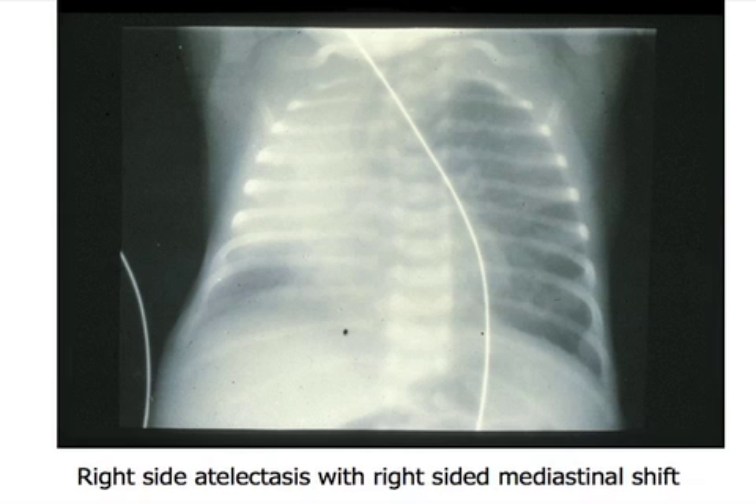This is complete right-sided atelectasis. Where's his heart? It's moved over to the right side. Why would his heart move to the right side? Because that lung collapsed — it shifts over when the lung collapses. What happens when you have a pneumothorax? It pushes the heart to the opposite side. So whenever you look at a chest X-ray, look at the position of the heart. With atelectasis, the heart shifts to the side where atelectasis occurs. With an air leak or pneumothorax, the heart shifts to the opposite side because it basically pushes everything over.